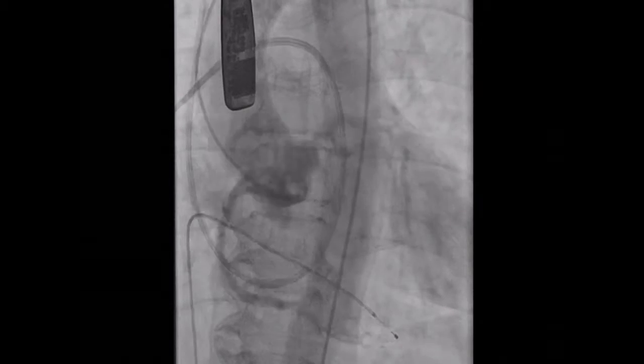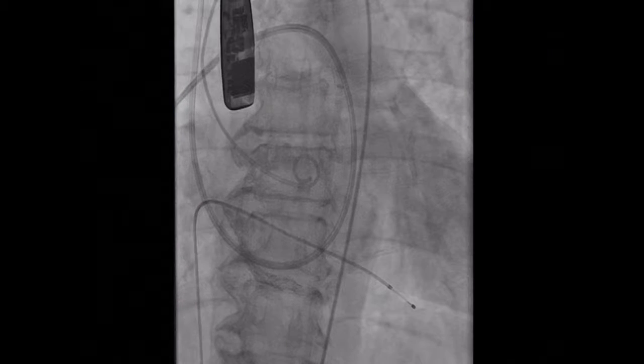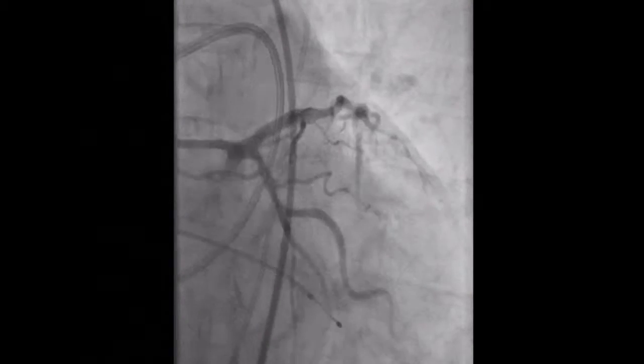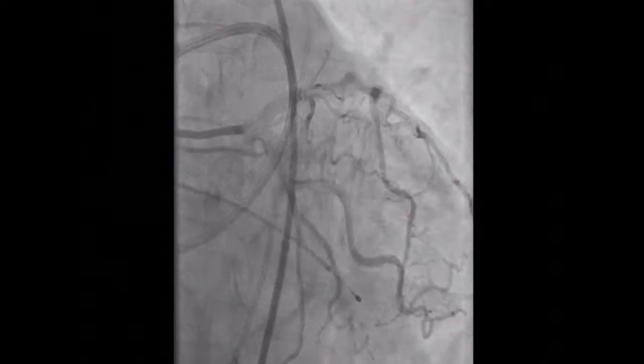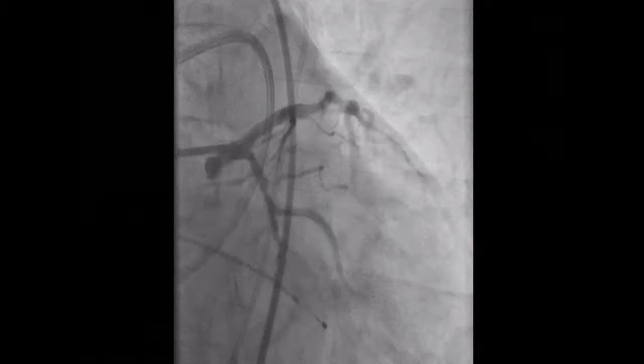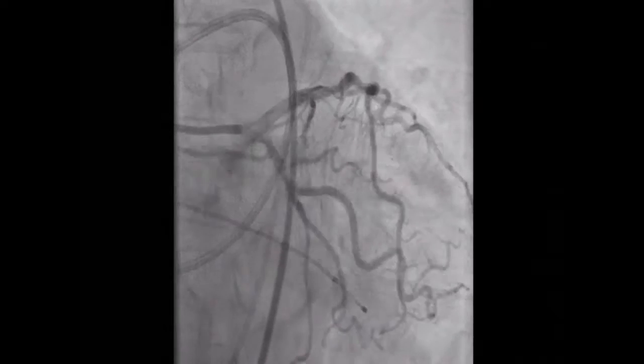Okay. I know there are issues with a problem with the loop, so we go to the next. Yeah, so there was no significant disease of the left main. Next, these are the cases we are talking about. If there is a left main disease, you put a stent in the left main first, wait 5 to 6 weeks, and then do the TAVR procedure.